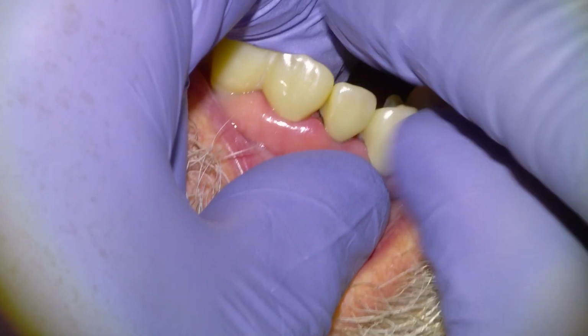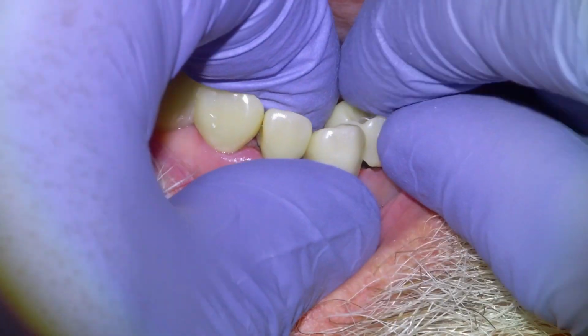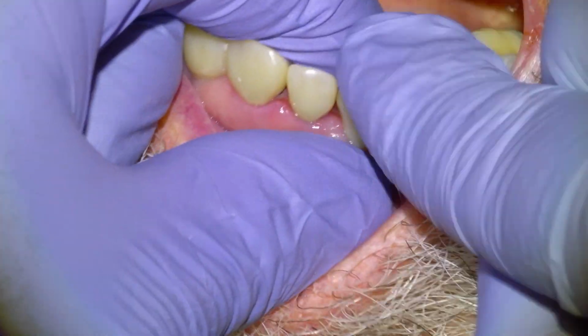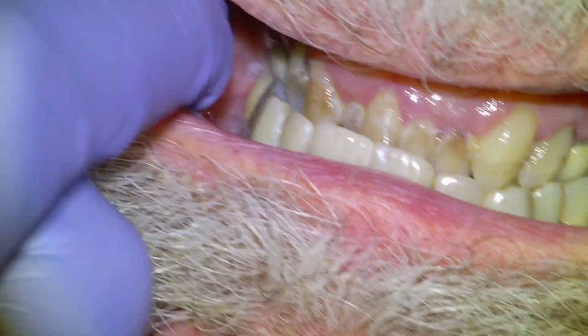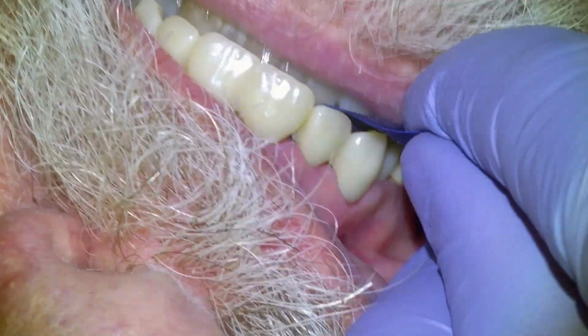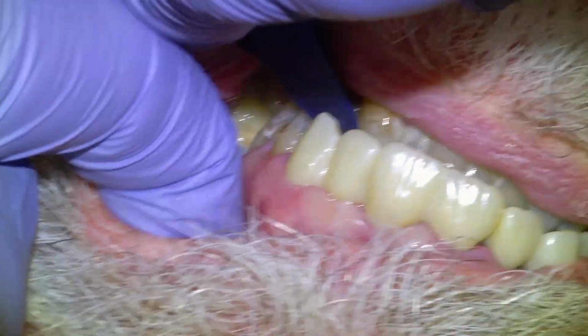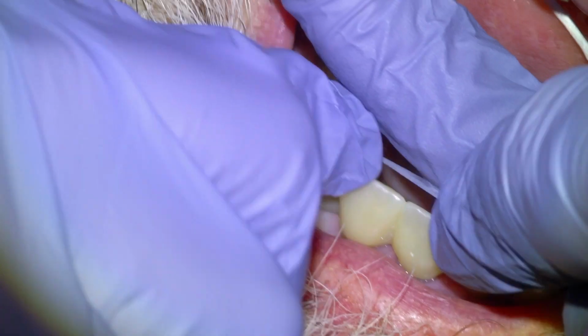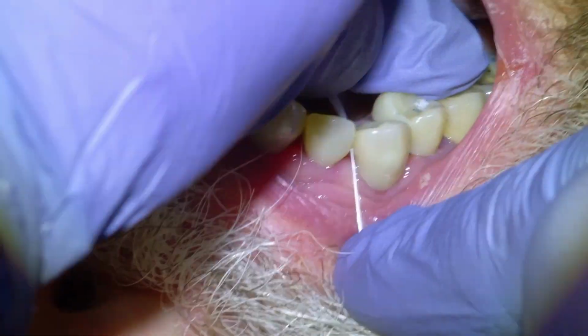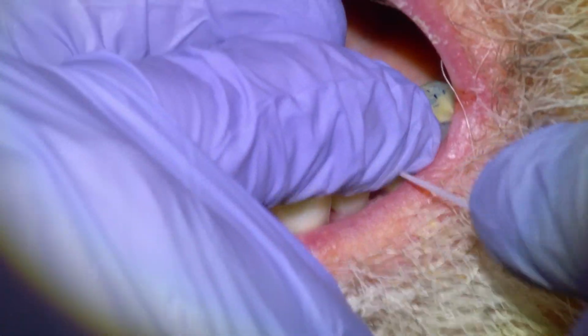So we're going to do a dry fit. Going to get the patient back, do a dry fit here, make sure that we're happy with the quality of the fit. We're going to check the bite for comfort. And we had good contact all the way around, so no adjustments to the bite. We're going to check the interproximal contacts with some floss, and we were happy with those too, didn't have to make any adjustments there. And then I'll give the patient a mirror and let him look at them and see that he's happy with the aesthetics.